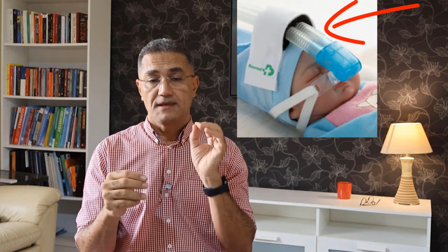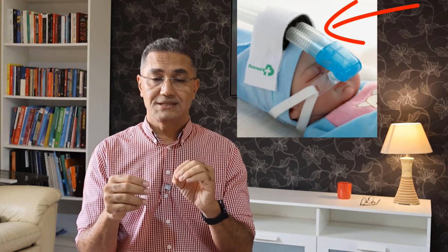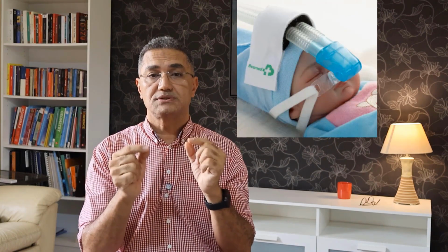This doesn't happen with the nasal mask. If you look at the nasal mask, you'll see it needs to be tightly sealed, with no leaks or air escaping. Why? Well, the reason is that the nasal mask is designed to create a closed system, ensuring that the air pressure is maintained and that the therapy is effective. With a nasal mask, any leaks can reduce the effectiveness of the treatment, so it's crucial to have a proper seal. In contrast, the nasal cannula is intentionally designed to allow some space for exhalation, as we discussed earlier.